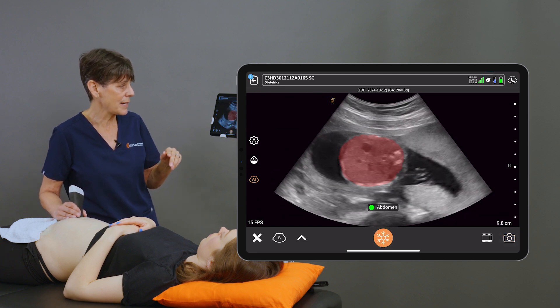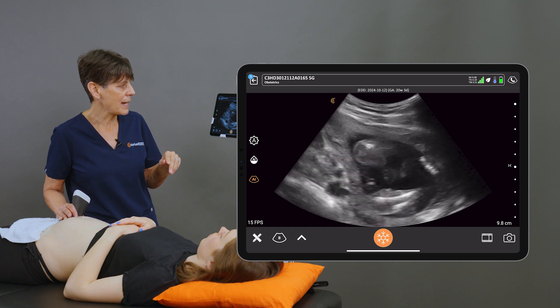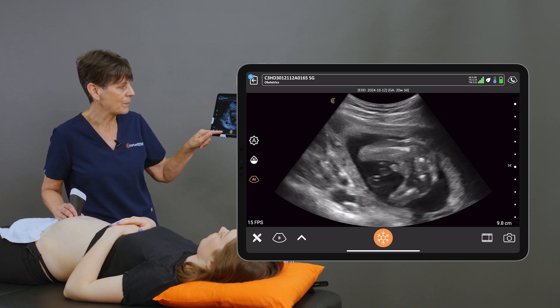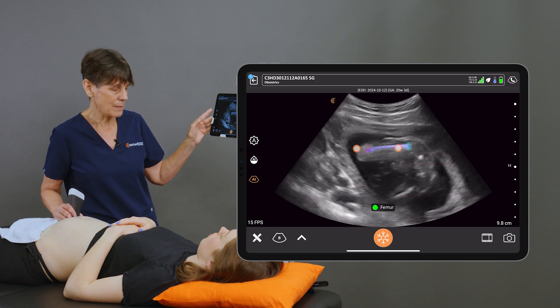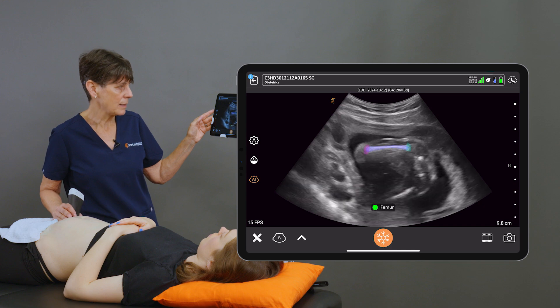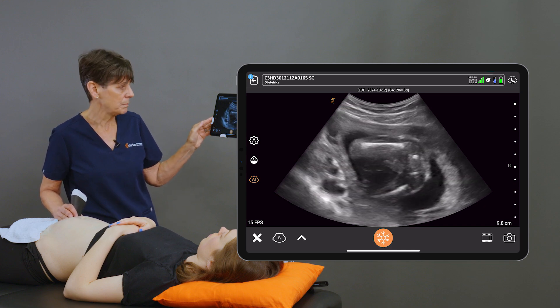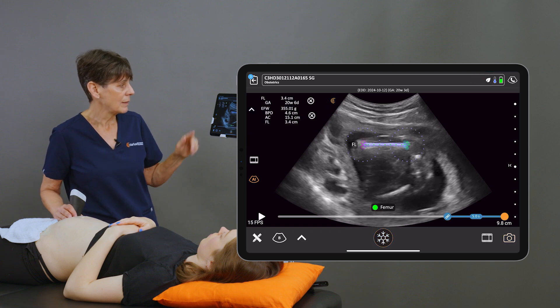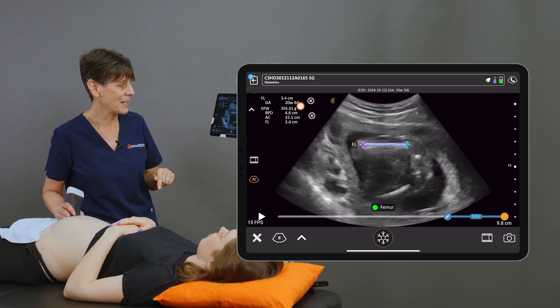Next we'll slide down to the femur. As soon as the AI sees the femur, it places that mask, but it also has two little colored ends. It's important that both of those ends are highlighted because that's where the AI is going to place the calipers. Once I freeze, calipers will be placed, we get an accurate measurement, and we can take an image.